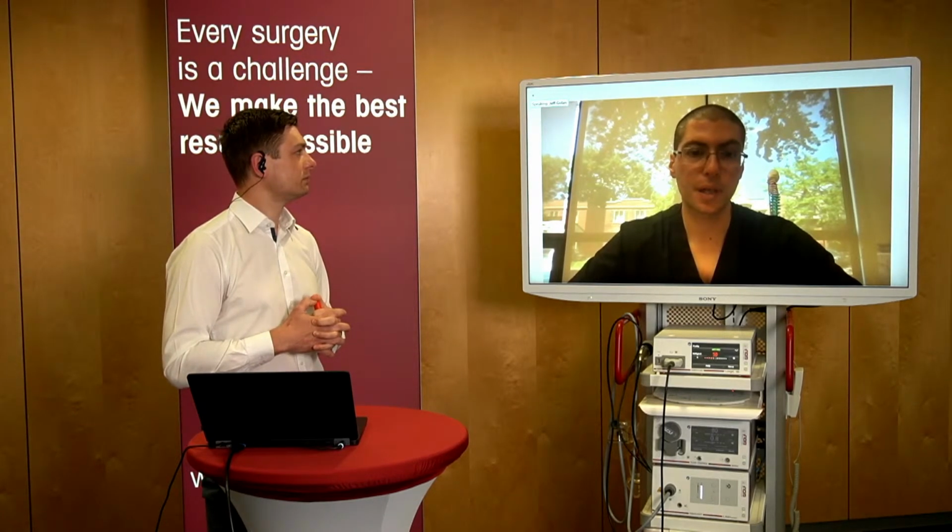So performing a lateral recess decompression from a transforaminal approach is actually quite challenging. I think it's a higher level of difficulty because you're exposing the anatomy from an unfamiliar point of view. It is certainly possible.